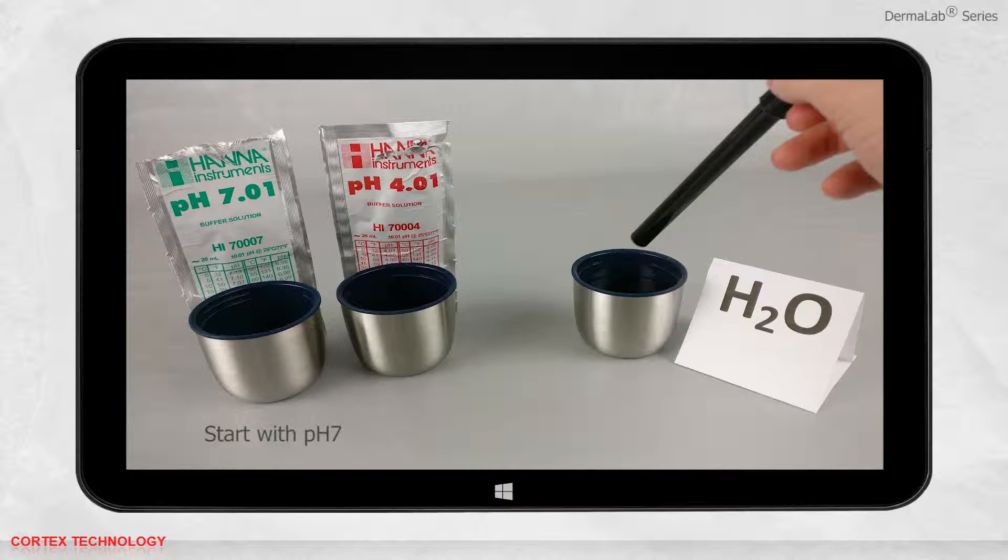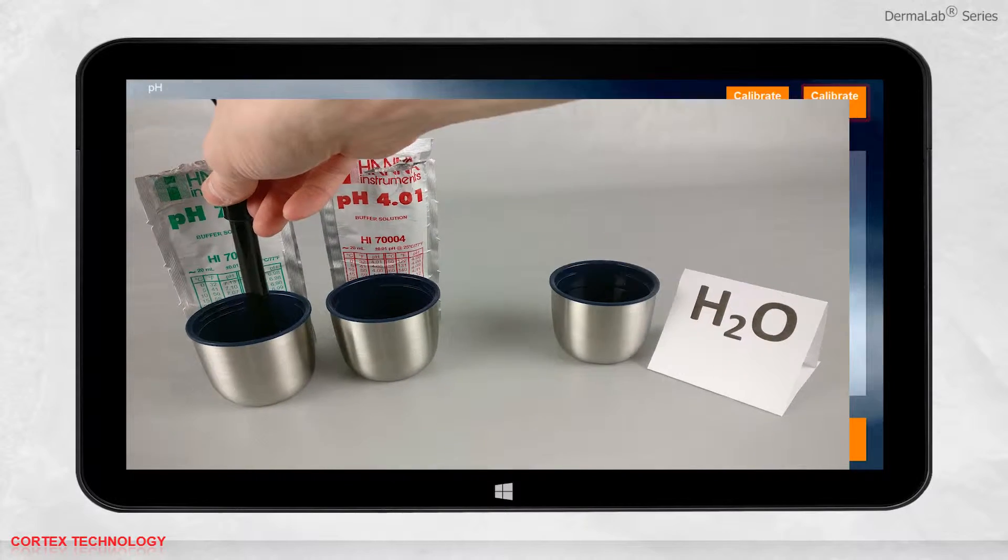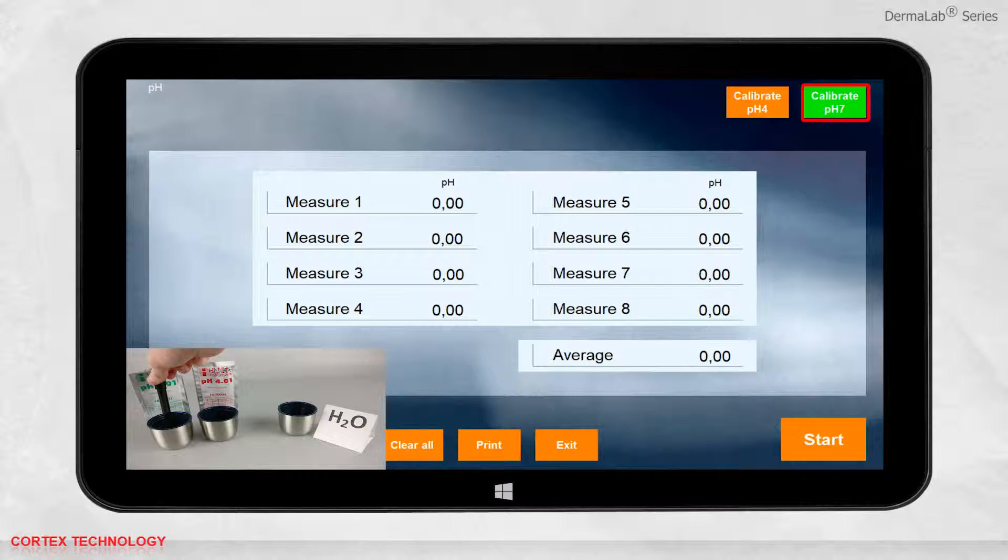Always start with the pH 7 solution. Insert the probe in the pH 7 and press calibrate in the software. The button will change color to green while the calibration is being performed. Once the calibration is complete, the color will change back to orange.